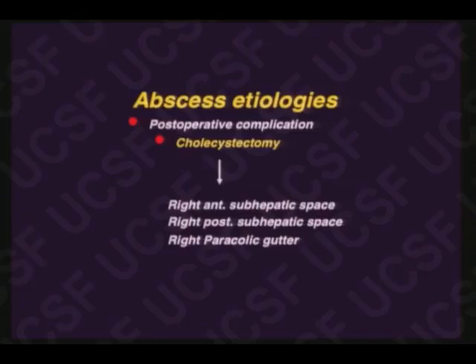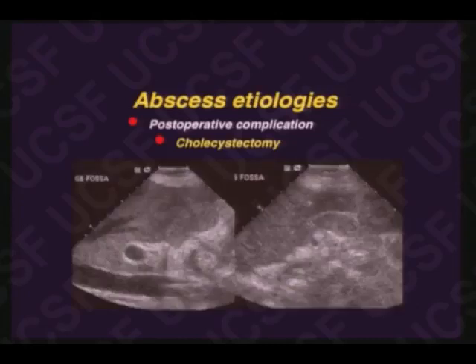So I get called from the intensive care unit. Dr. Philly, we can't send this patient for a CT scan. He just dropped his blood pressure, is running a fever, he's 10 days post-op cholecystectomy. I go up, I examine, those three spaces are clean. I don't care if he has gas overlying the left infracolic space. My study is negative. I will be right. This patient just has a hematoma. He didn't actually have an abscess. But again, I'm going to find it.